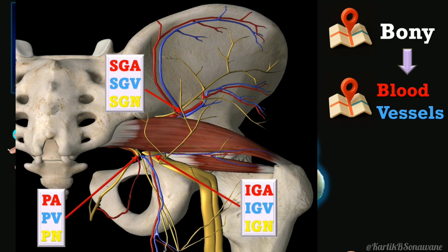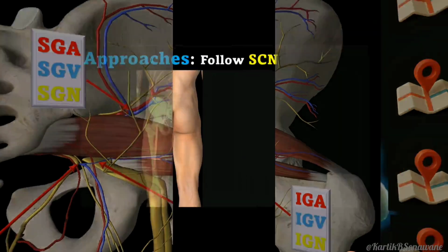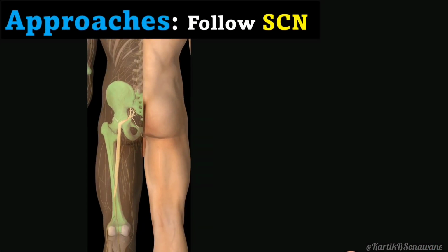It is also essential to understand the muscular landmarks which lie above and below the sciatic nerve and which help in identifying the nerve due to its anisotropic property under the ultrasound. Identifying the accompanying nerves along with the sciatic nerve also helps determine the extent of the analgesic coverage for your block. So how do we remember the many described approaches to the sciatic nerve?